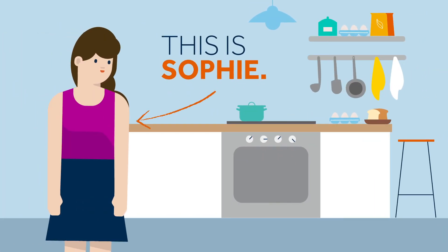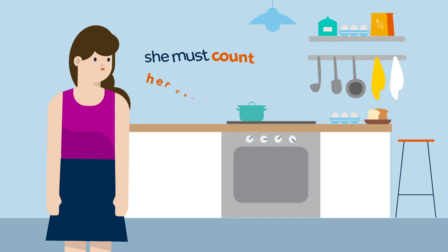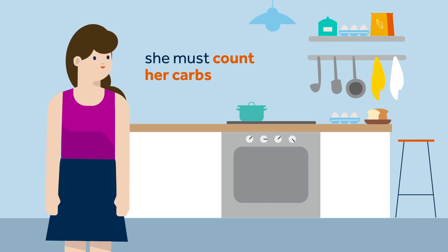This is Sophie. This evening, while Sophie is preparing her dinner, she remembers that Kelly told her she must count her carbohydrates when using both manual mode and the SmartGuard feature when she eats. This is because when in the SmartGuard feature, the auto correction adjustments are not intended to correct large mismatches in carbohydrates, although they will help when you slip a bit when counting.